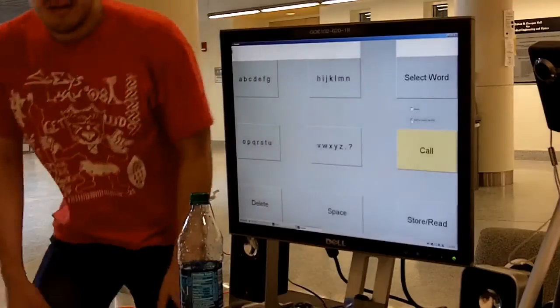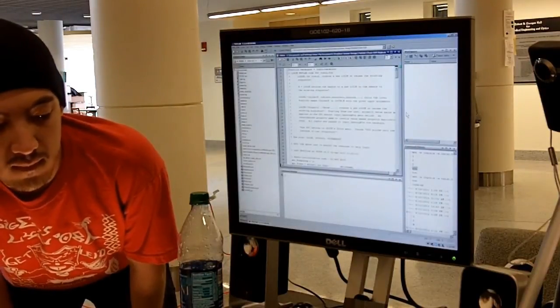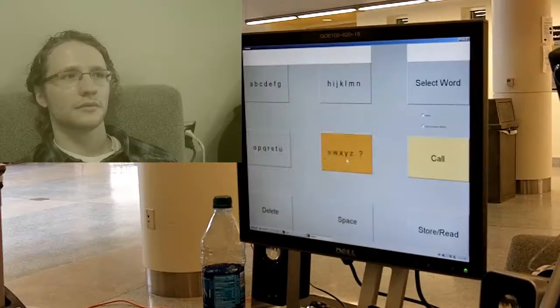Since then, we've put in a fair amount of hours. I don't know, what do you guys think we average a week? Anywhere from 4 to 10 a week. I mean, depending on the week and what has to get done. 4 to 10 a week per person. Per person, yeah, per person. How do our calibration images look? I don't know. All right, we had 2 circles.